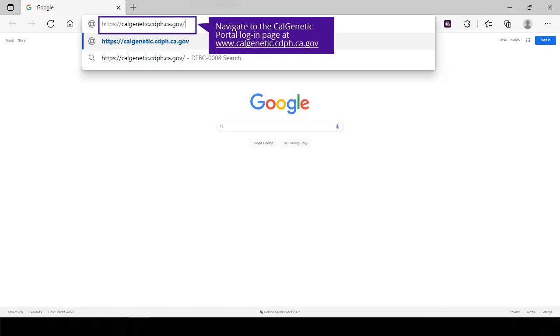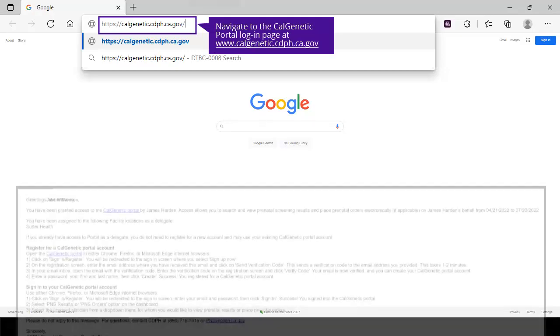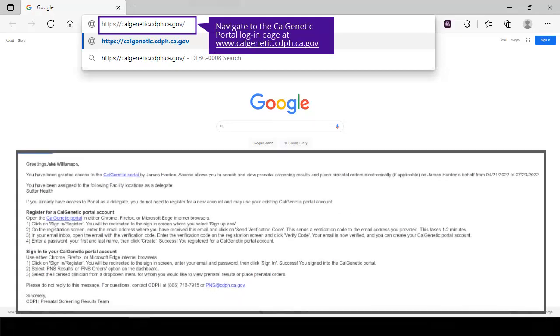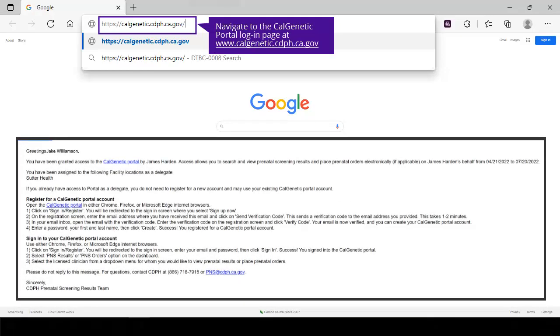Navigate to the CalGenetic Portal login page. As a delegate, you will be able to access the CalGenetic Portal through a secure link that will automatically be emailed to you once a physician has added you as their delegate. When you click that link, you will be directed to the CalGenetic Portal login page to create your user account or, if a returning user, to login.